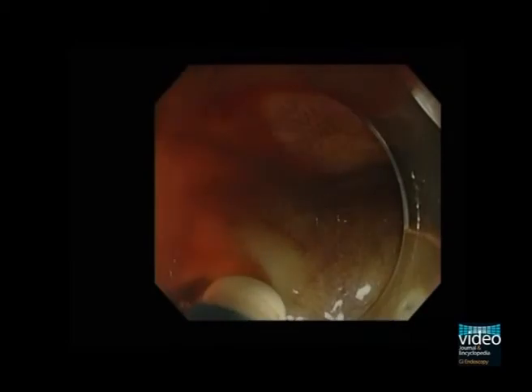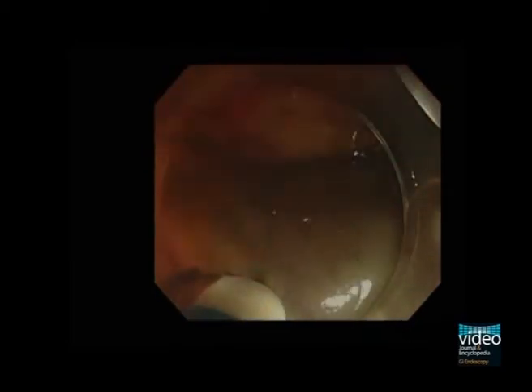After a submucosal fluid cushion is obtained by injection, we start incision of the anal quarter of the circumference. Incision from its left wall side is preferable with consideration of gravity, because submerging the lesion into the collection of fluid can disturb endoscopic view. After incision by EndoCut1 mode, we make deeper dissection for the anal half of the incision by swift coagulation mode to make following dissection easier.